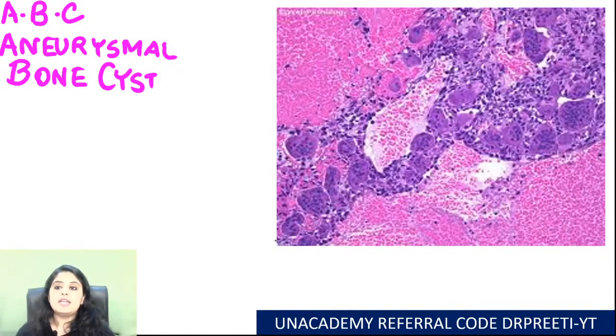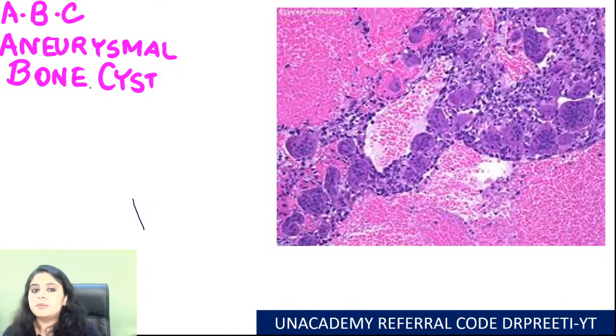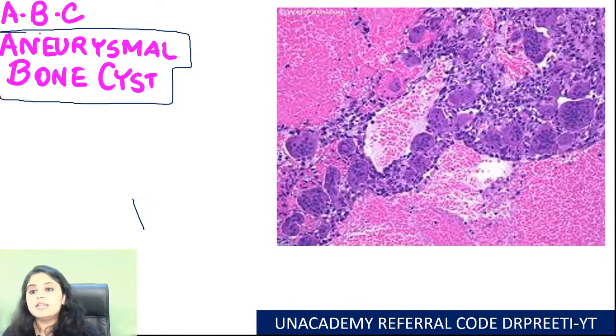Okay, coming on to the next, another very rare lesion but important. The word tells you everything about it. Aneurysmal bone cyst.